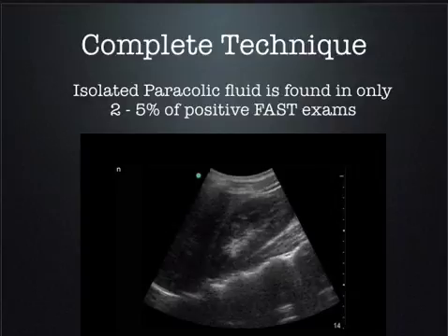Remember, fluid takes time to transit up from the abdomen once you lay them flat. The time where you see this positive, where it's the inferior pole, is almost universally the same kind of patient. It's the ambulatory patient that is going, oh, my belly hurts. And then you lay them down, because they come walking in triage, you lay them down and you scan them, and the fluid is moving from their pelvis up here, and it's almost always an ectopic pregnancy.